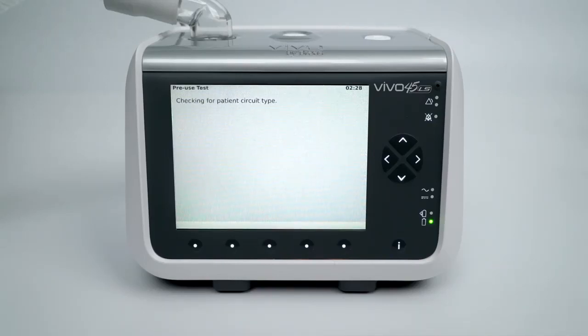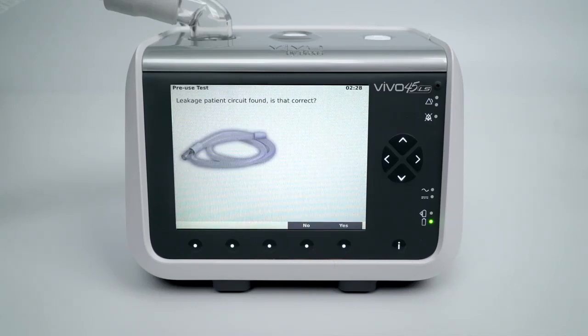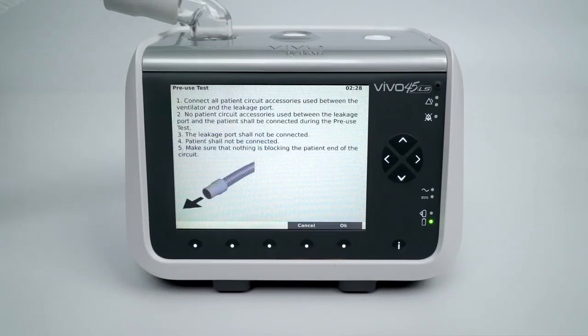The screen will now indicate the type of circuit that the Vivo 45LS has detected is attached. If this is correct, click the button underneath the Yes option. If not, click the button underneath the No option. If you select Yes, you will be provided with an additional set of instructions that will need to be followed. Carefully follow all instructions and make sure to attach or remove sections of the circuit as directed, then click OK.